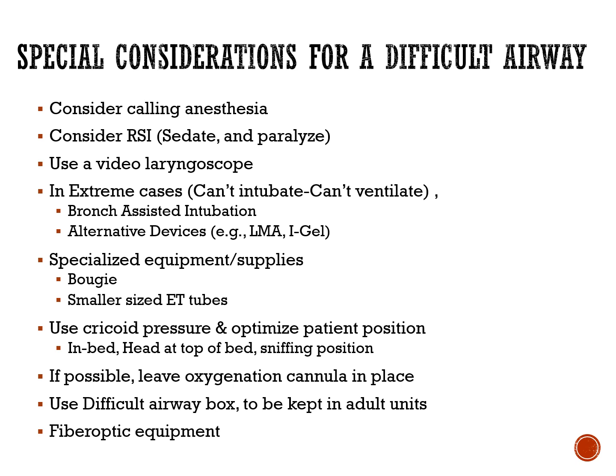Cricoid pressure is actually known as the Sellick maneuver, with an S, Sellick maneuver. It was originally done to help minimize the likelihood that the patient will aspirate stomach contents into their trachea. The idea there is if you're manually ventilating the patient, some of that air is likely to go into the belly, and they're at risk for an aspiration. Sometimes you're intubating a patient who's eaten recently. So again, the Sellick maneuver or cricoid pressure may be to protect that airway. But it was also found that it could help position the glottis in a way that you're more likely to actually see it. So again, that's something to consider as well.